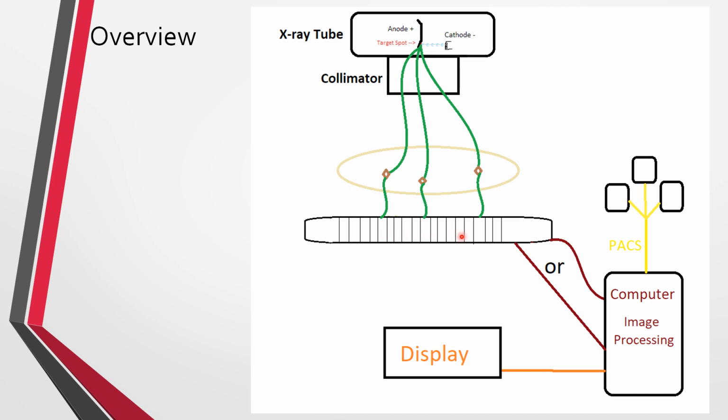The detector has a matrix of dels inside it, and these signals will interact with that. It will interact with the capture element first, and that will either convert to light, in the indirect style, and then be converted to an electrical signal, or it will be converted directly to an electrical signal, depending on the technology used in the image plate.